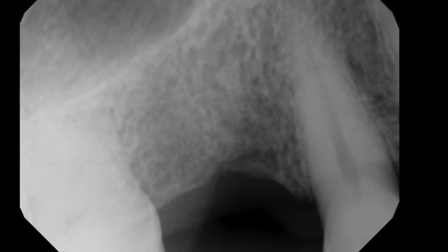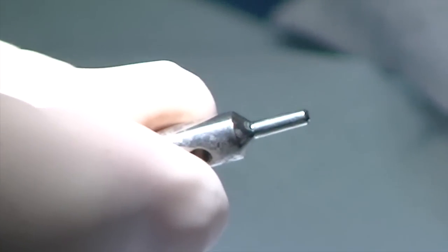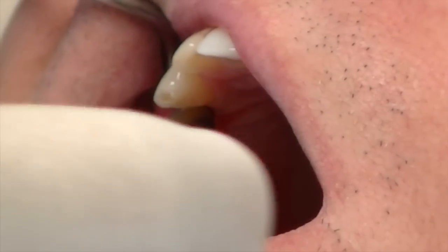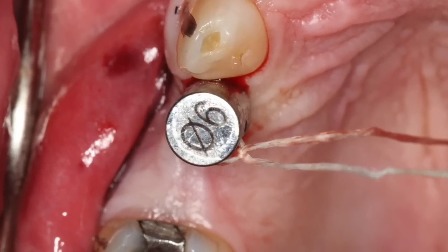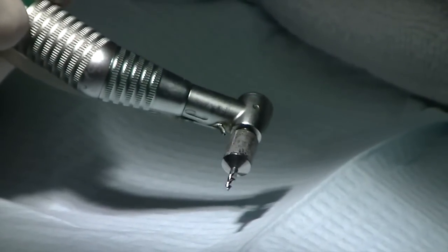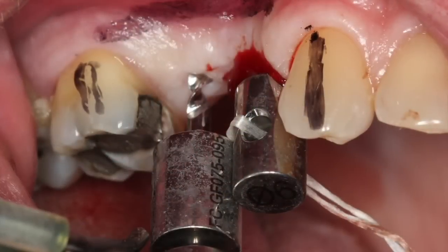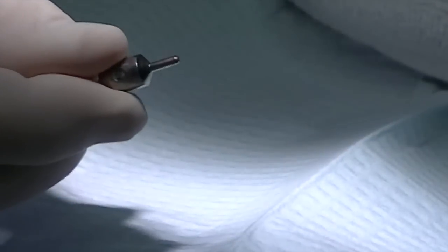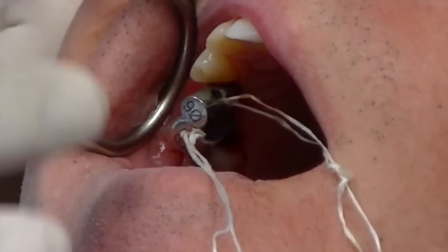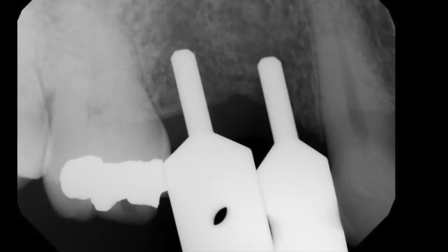So we have a space and we have to determine what size teeth we're going to be able to place. We then have the same size cylinder post that will engage into that preparation. I tie some floss around it so we don't lose it, and you can start to virtually see what that tooth is going to look like prior to moving any further. We do the same thing with the second tooth, splitting the difference — using the pilot drill, then setting the cylinder in place to make sure we're happy with our positioning. Minimum of 2 millimeters from adjacent teeth and 3 millimeters from adjacent implants. You can see here how the final crowns will be positioned correctly in that edentulous ridge.